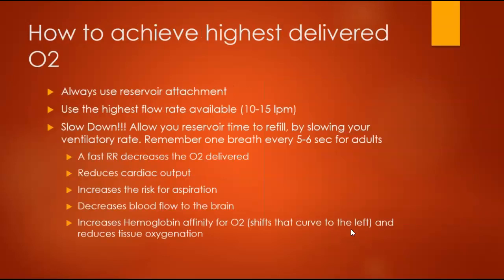Okay, so big takeaways with this: we always need to use that reservoir attachment. Otherwise, we're not going to get 100% FiO2. We want to use the highest flow rate available, so we're going to turn our oxygen flow meter up to full blast. The other big important thing for me to remind you guys of is to slow down. Slow down.